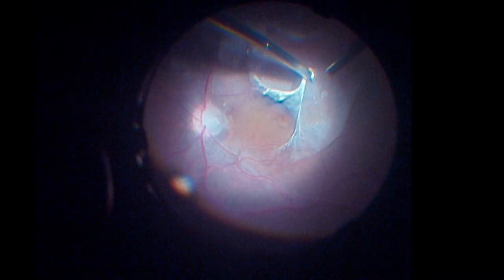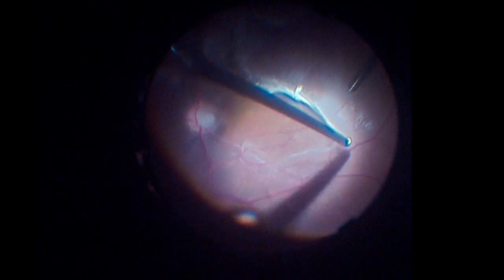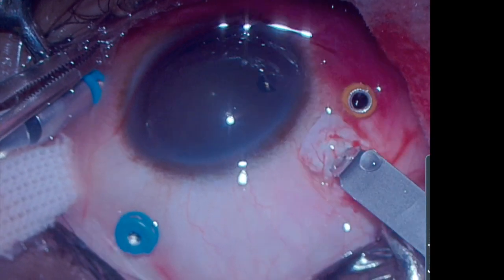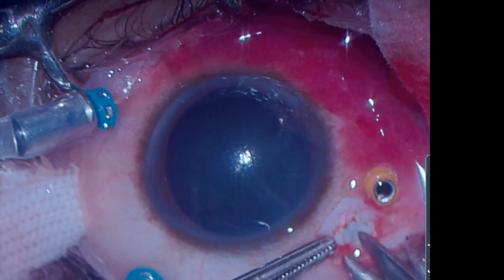A gentle and complete PVD was attempted, as literature suggests vitreous traction to be responsible for optic disc maculopathy development, and spontaneous resolution has been reported following completion of PVD. A site over the sclera was identified. A small graft was harvested from the superior aspect of the sclera and placed over the optic disc pit.